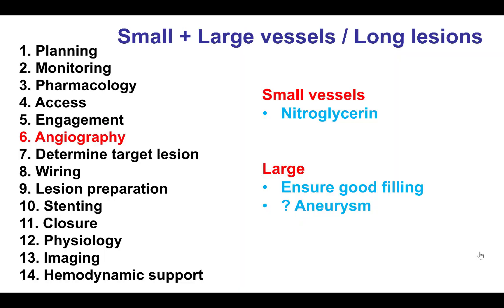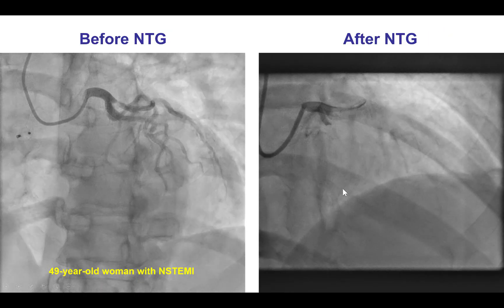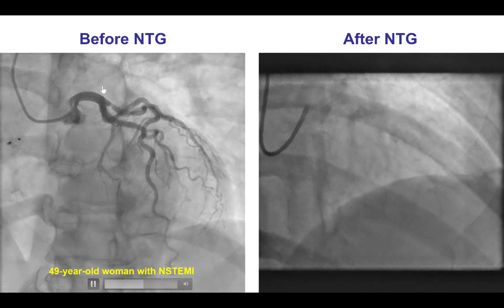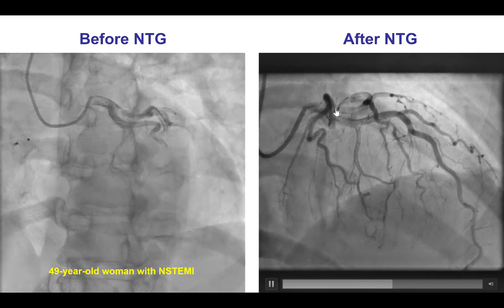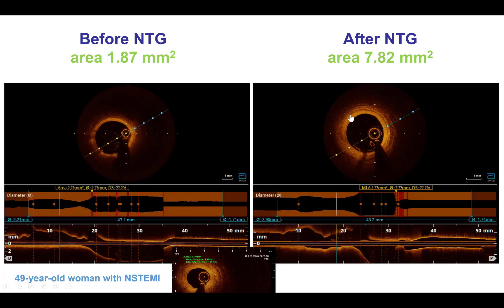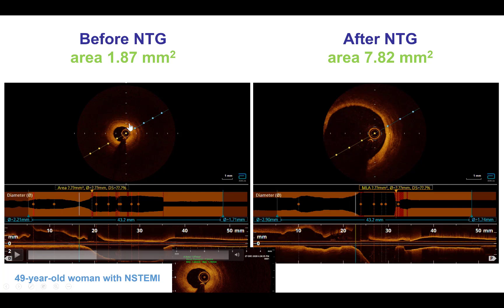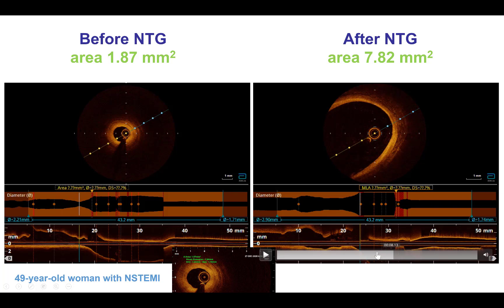When it comes to angiography, it is particularly important for small vessels to give nitro to ensure maximum dilatation of the vessel, and for large vessels to ensure good engagement as well as good injection of contrast. These are examples of how nitro can affect the appearance of the angiogram. There appears to be a lesion in the circumflex that disappears after giving intracoronary nitroglycerin. The same thing is shown on intravascular imaging with OCT — a very small area before giving nitroglycerin that becomes much larger after.